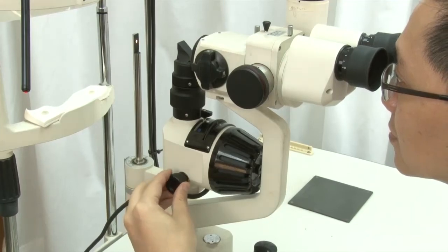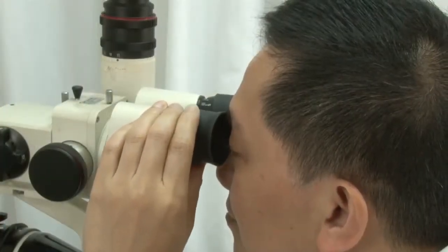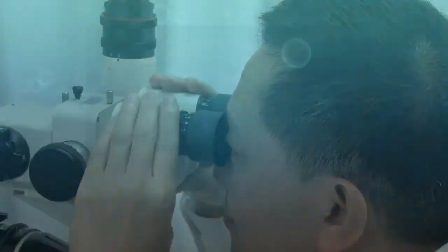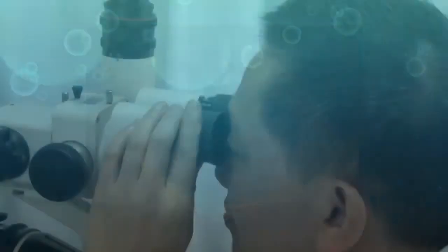Next, view through the other eyepiece. Repeat the same steps and note the settings of both eyepieces for future use. Finally, adjust the interpupillary distance of the eyepieces for binocularity and stereopsis.